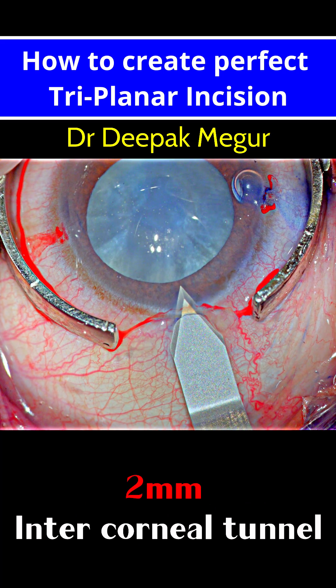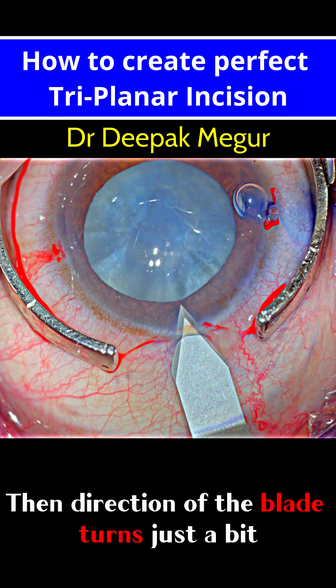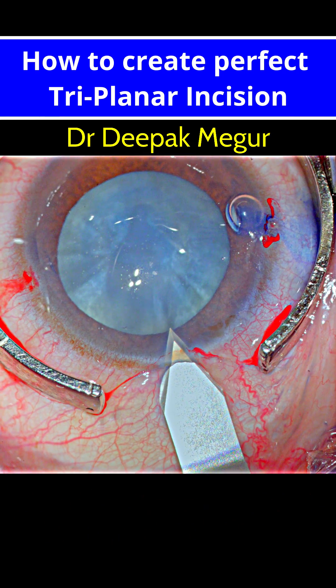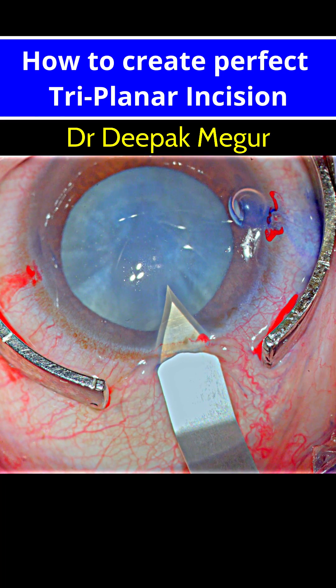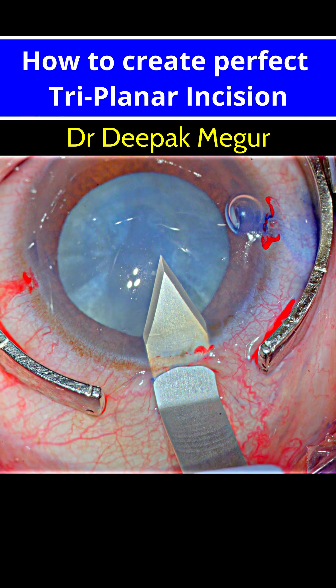This creates an intracorneal tunnel of 2 mm, and then the direction of the blade turns slightly so that it becomes parallel to the surface of the iris. Then it perforates Descemet's membrane.